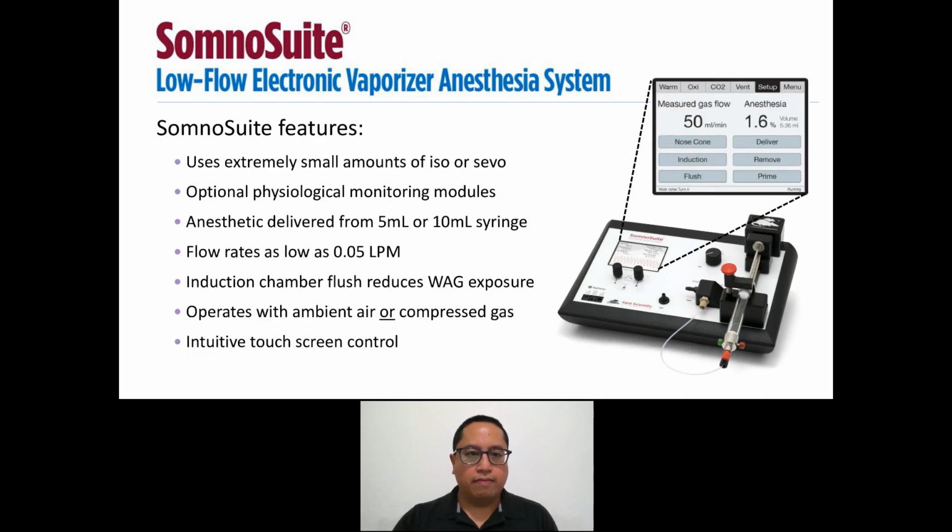The SomnoSuite has an intuitive touchscreen control. Both the flow rate and anesthesia percentage are displayed in large numbers along the top of the screen. Along the top are tabs for additional modules that can be added. You push the remove button for when you need to fill your syringe.